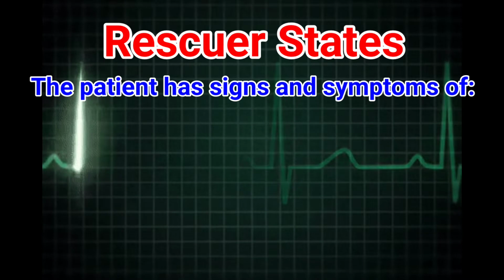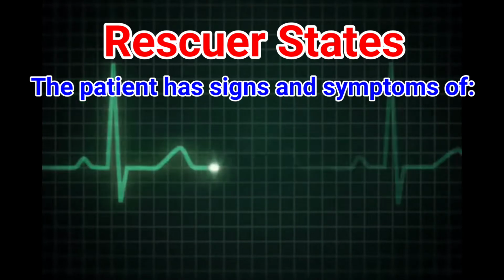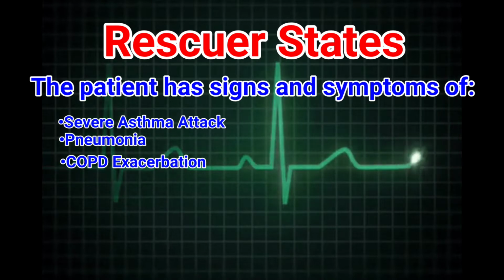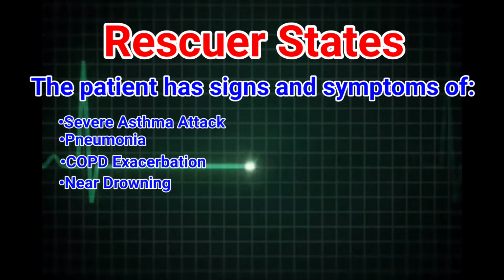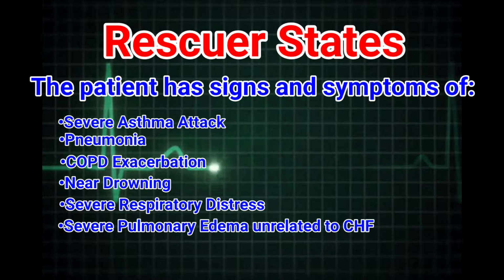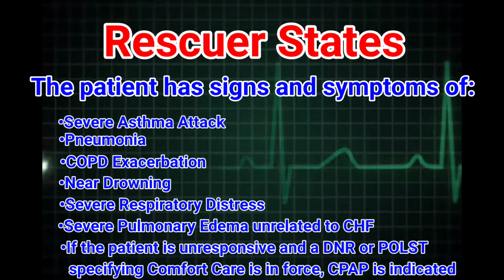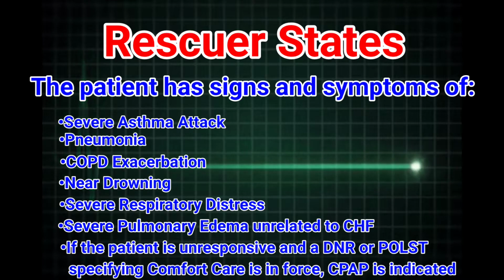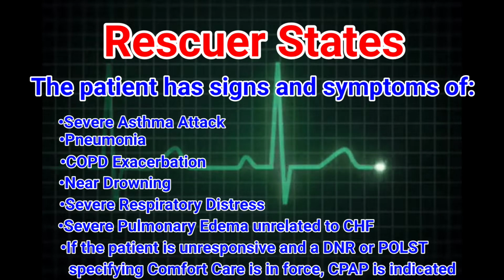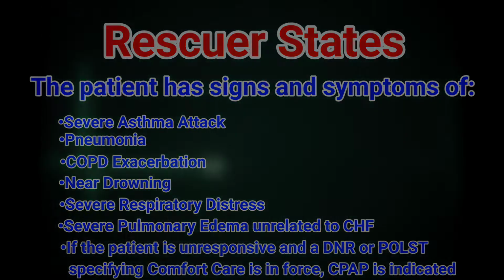Rescuer states, the patient has signs and symptoms of severe asthma attack, pneumonia, COPD exacerbation, near drowning, severe respiratory distress, severe pulmonary edema unrelated to CHF. If the patient is unresponsive and a DNR or POLST specifying comfort care is in force, CPAP is indicated.